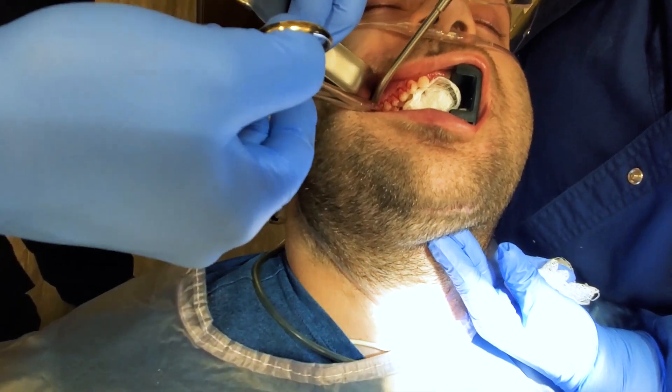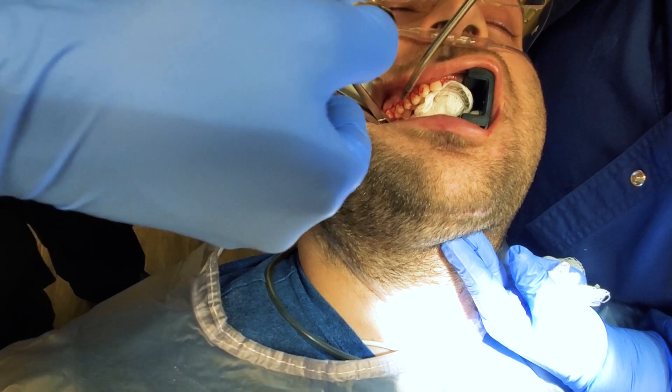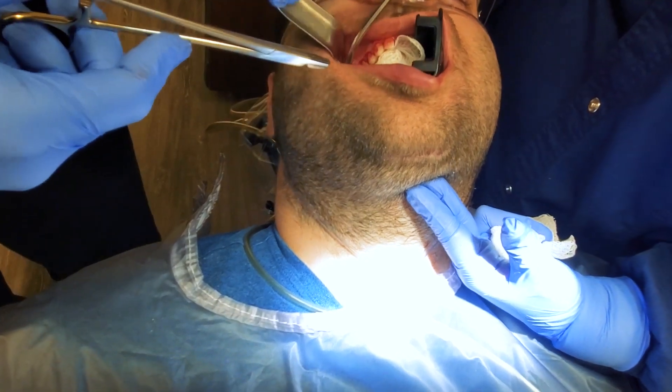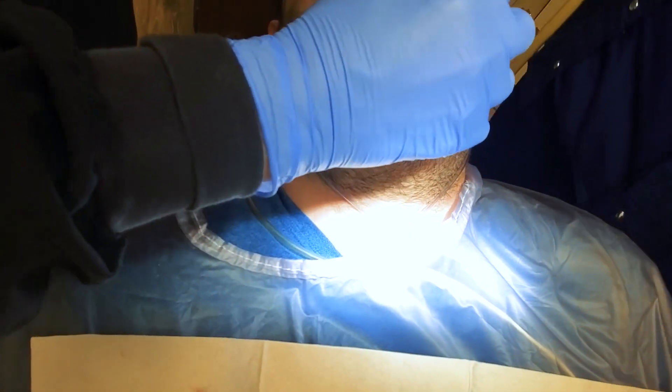This will all heal and go back to normal, but the gums are definitely not happy about having metal through them for several weeks. We'll get the bottom out and take a post-operative radiograph to make sure there are no retained wires or foreign bodies.